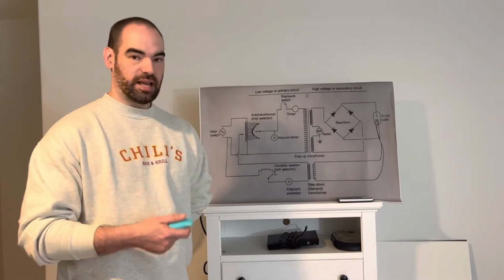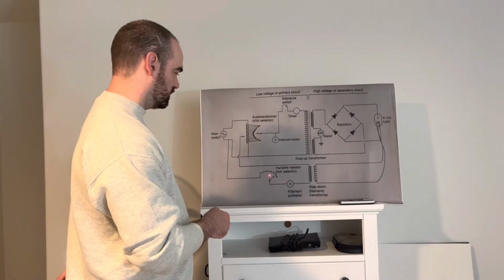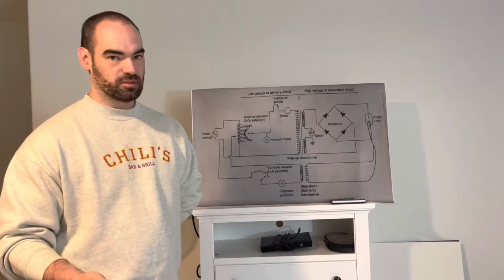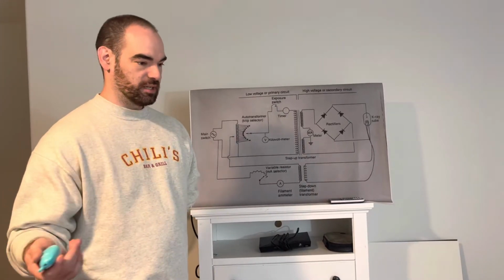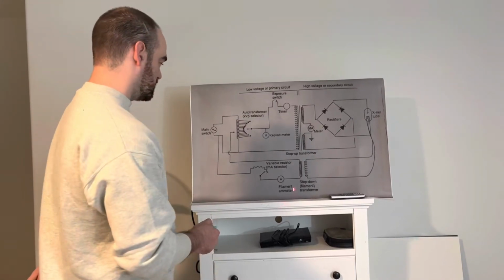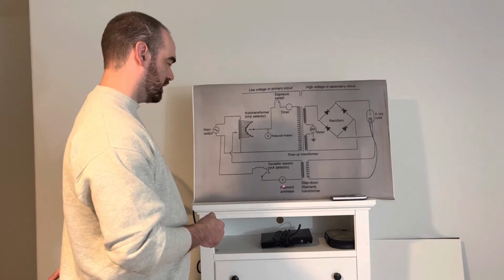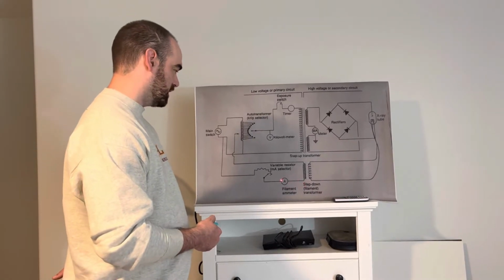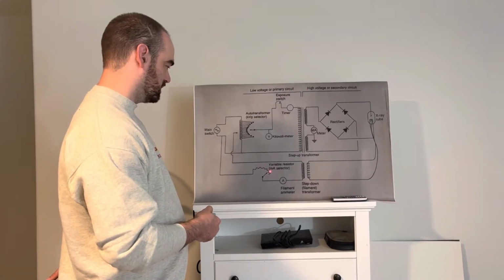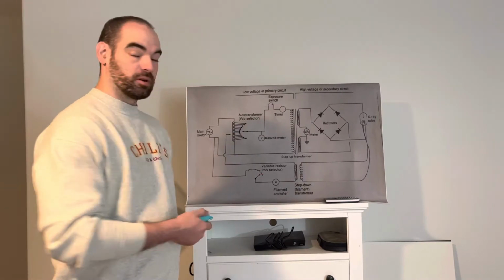It all basically happens at once, but at line number 3, through the filament side, you'll go to the variable resistor, and that's where the technologist will select the mA. Say we have a milliamperage of 25. So the filament ammeter will read the mA of 25, and the mA selector will pick that up, and we'll call that induction number 2.